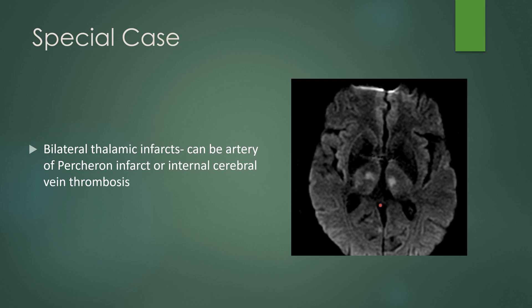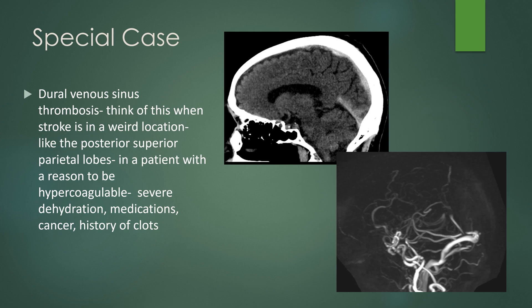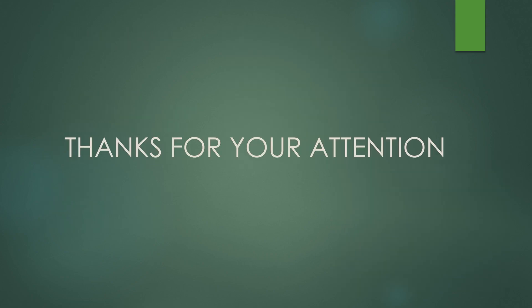Think of dural venous sinus thrombosis when you have a stroke in a weird location, such as the posterior superior parietal lobes — the superior sagittal sinus drains this convexity area. If a patient is hypercoagulable — severely dehydrated, on relevant medications, has cancer history, or a history of clots — check the non-contrast head CT. A thrombosed dural venous sinus appears bright, almost like the patient had contrast. In this case, there are clots in the superior sagittal sinus and straight sinus, and the MRV shows no flow within the superior sagittal sinus. Thank you for your attention.